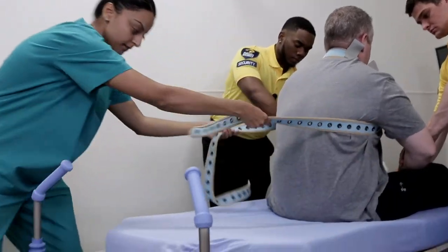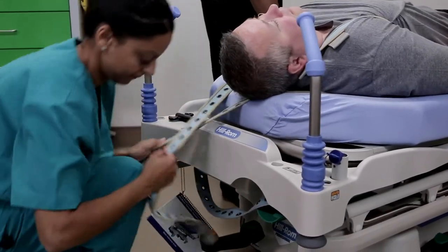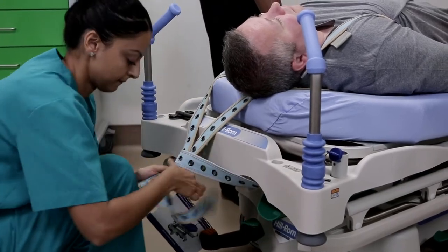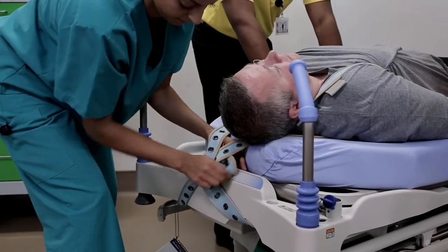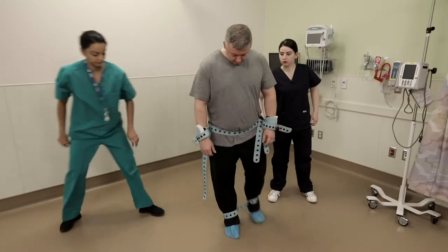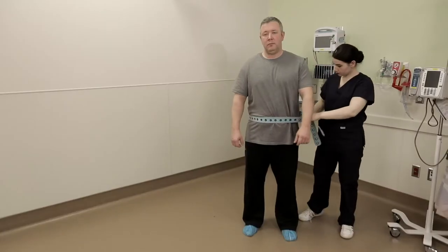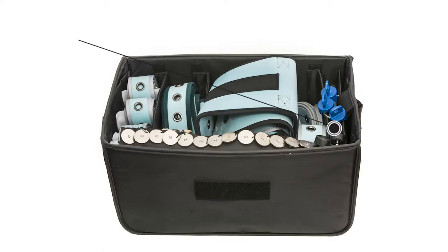On certain stretchers or beds, the strap can be used as a convenient attachment point for any belt, particularly for the long utility strap used to control the torso. For mobile restraining, the strap can be used as a soft shackle to limit running or kicking. When two straps are buckled together, they can be secured around the waist, attached to limb straps, and adjusted to any length.